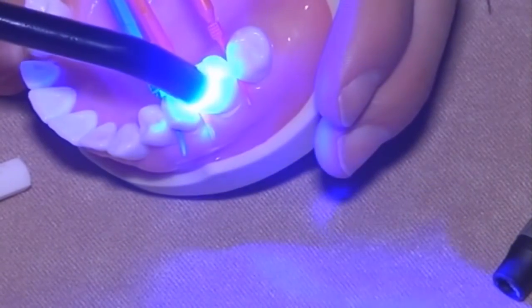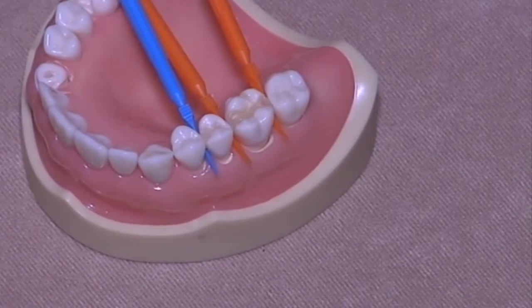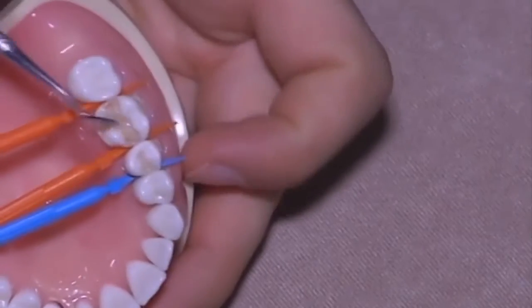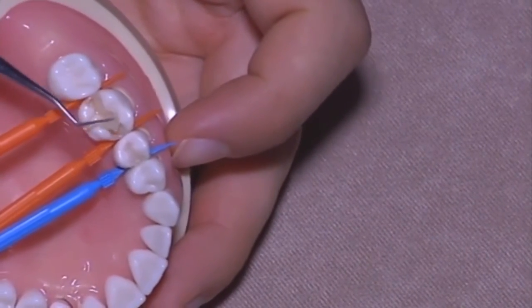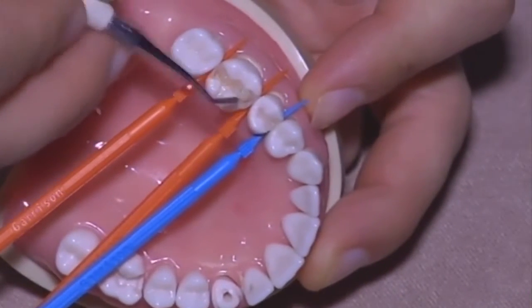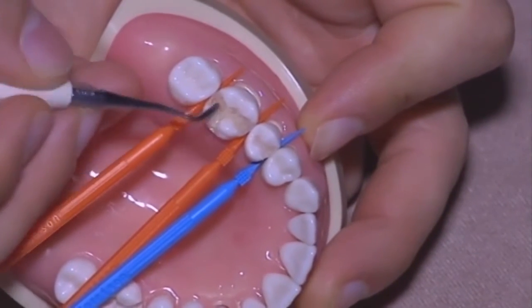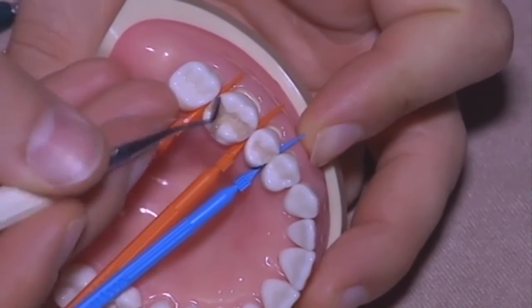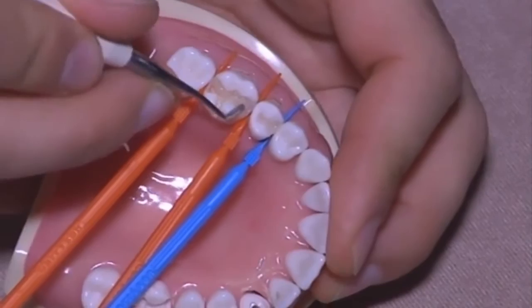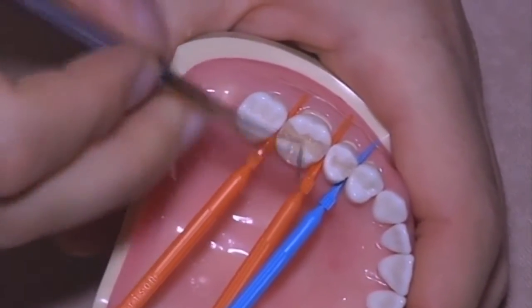And light cure. Fourth layer. Always the same procedure.